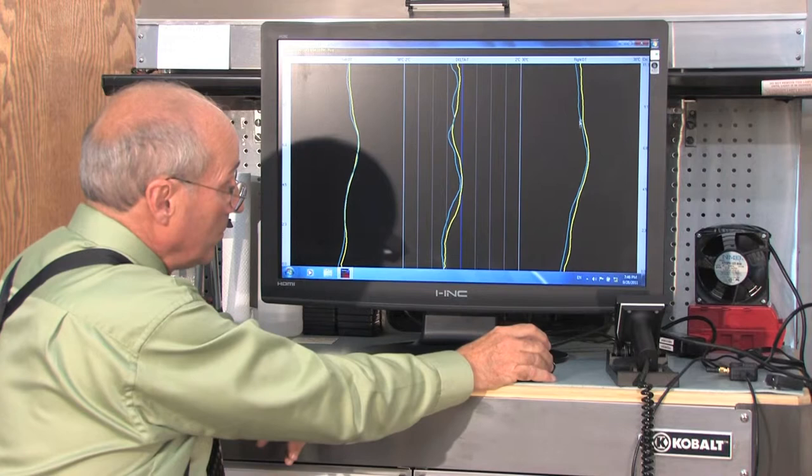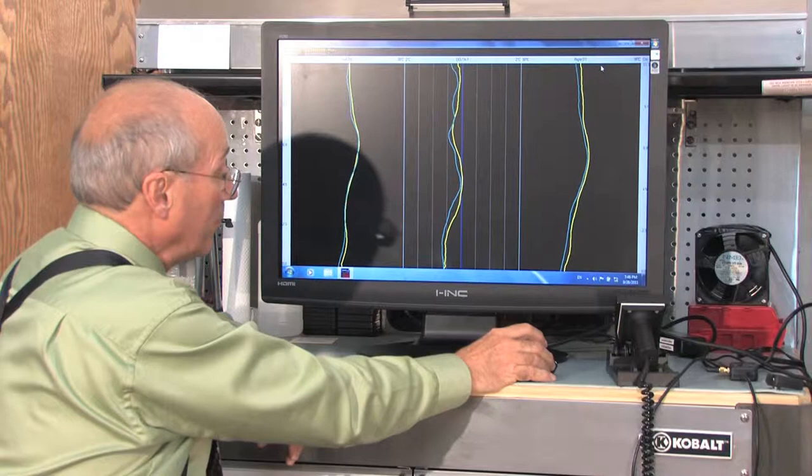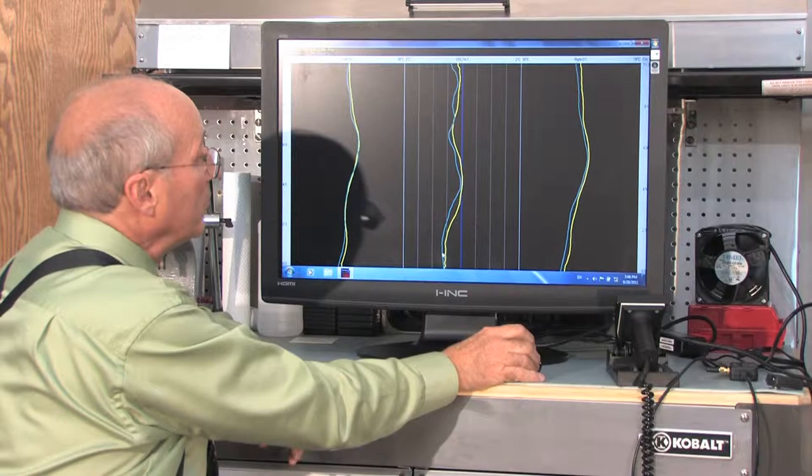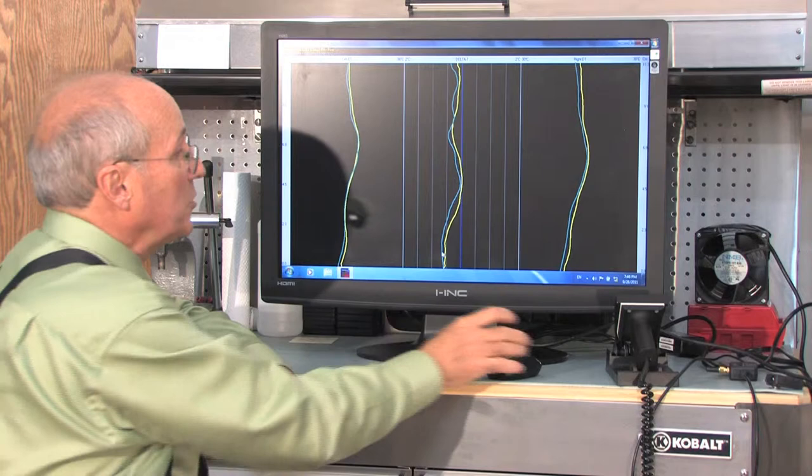These two lines represent two graphs taken on that day on the right side of my spine. These were read by the right barrel of the scanner. These were read by the left barrel of the scanner. The center graph is what you would have received or seen with the traditional thermocouple device that can only measure differences. So this is the difference in temperature from left to right.